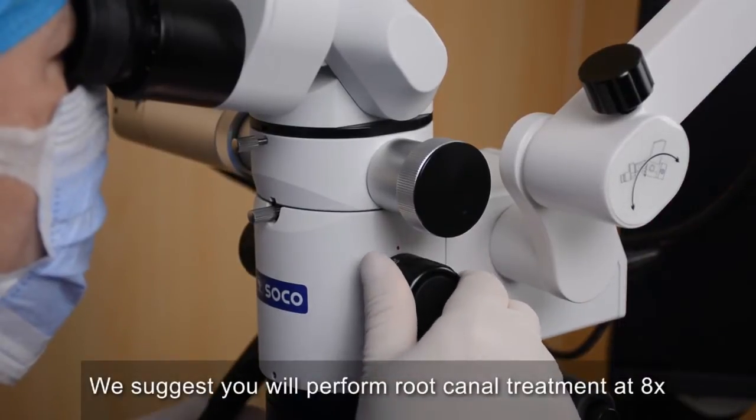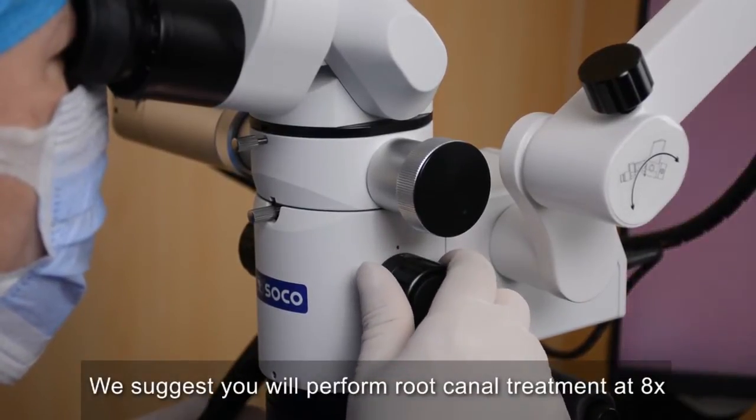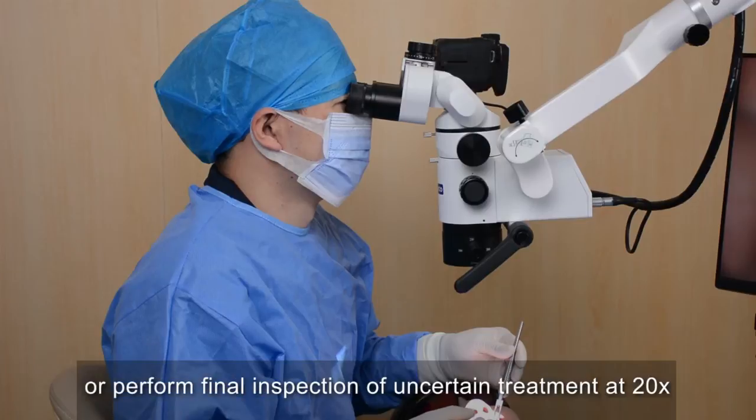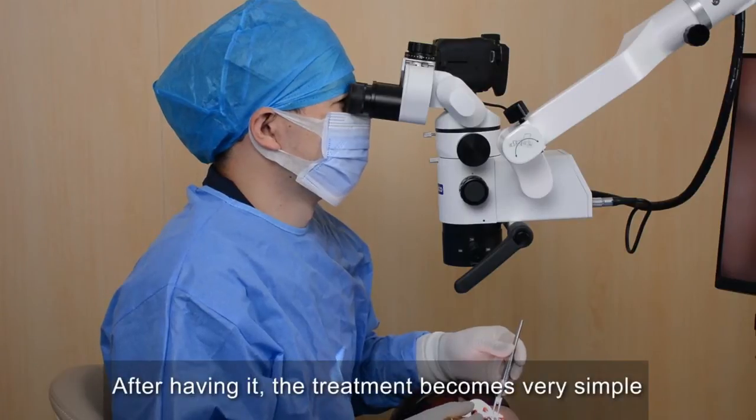We suggest you perform root canal treatment at 8x, or perform final inspection of uncertain treatment at 20x. With this, the treatment becomes very simple.